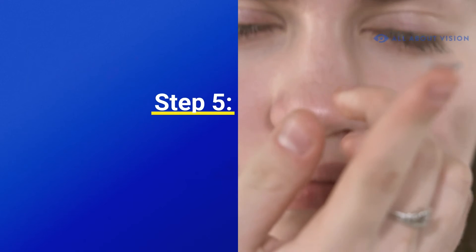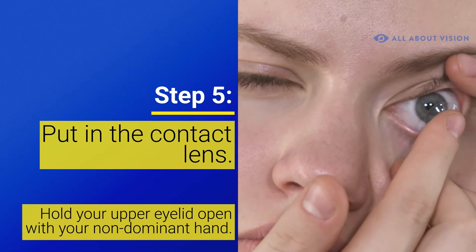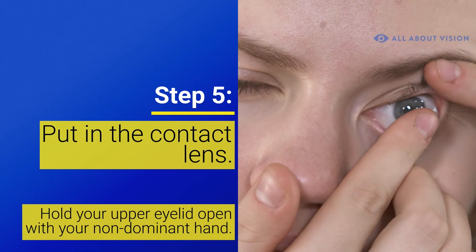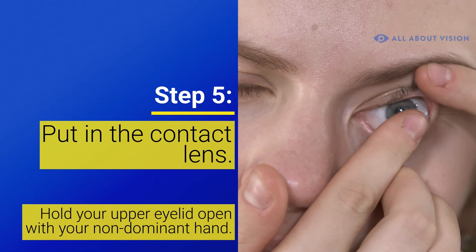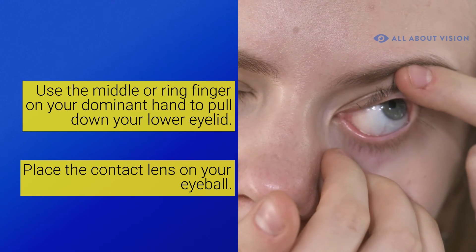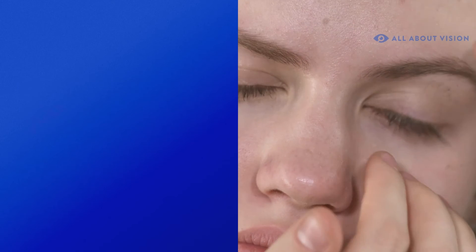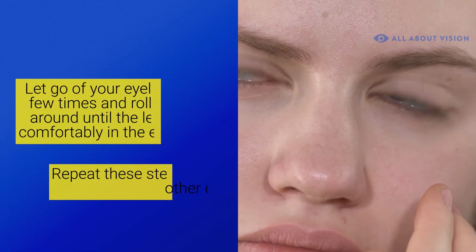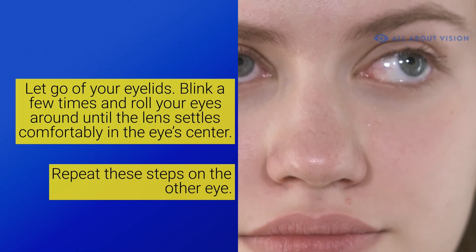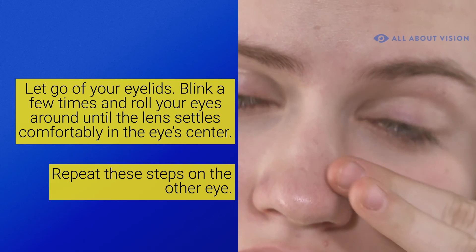Step 5. Put in the contact lens. Hold your upper eyelid open with your non-dominant hand. Use the middle or ring finger of your dominant hand to pull down on your lower eyelid. Place the contact lens on your eyeball. Once you've done this, let go of your eyelids. Blink a few times and roll your eyes around until the contact lens settles comfortably in the eye center. Repeat these steps on the other eye.